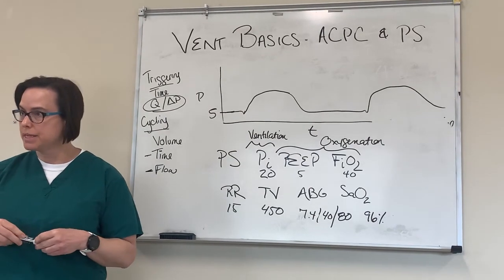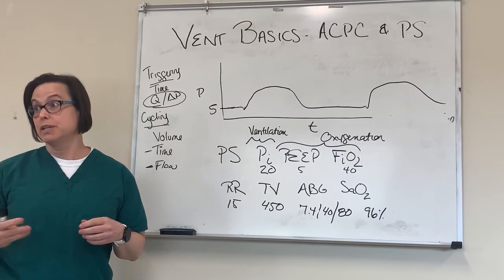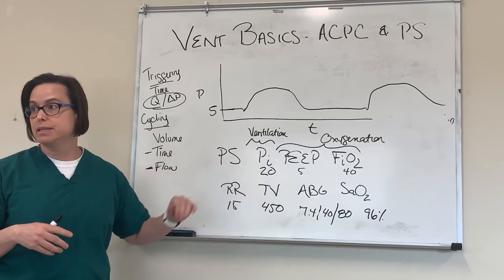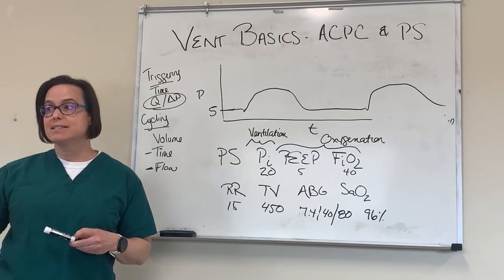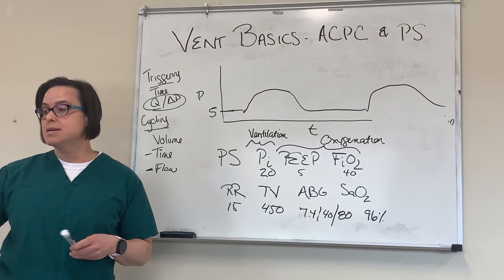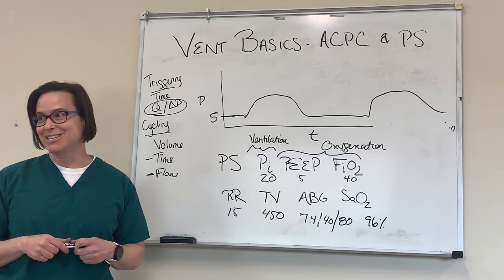Okay, does that all make sense? Okay, so those are our 3 basic modes of ventilation: ACVC, ACPC, and pressure support. We'll talk about one more advanced mode a little bit later, but thanks for learning this because you're gonna wanna know it if we do that daisy chain stuff, okay?